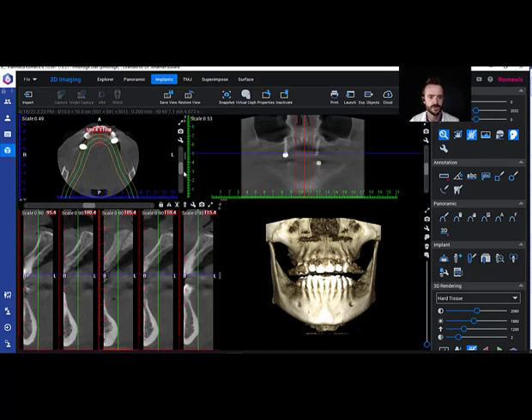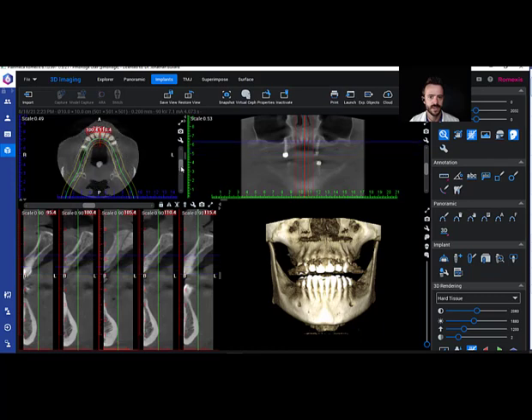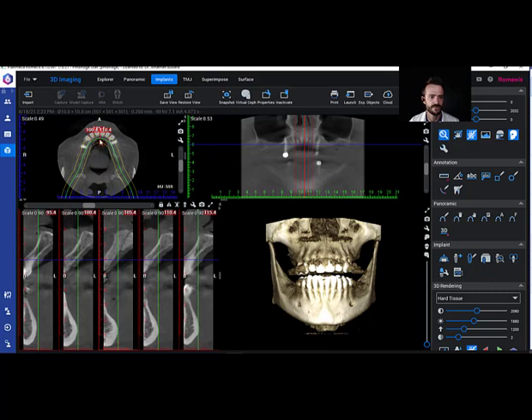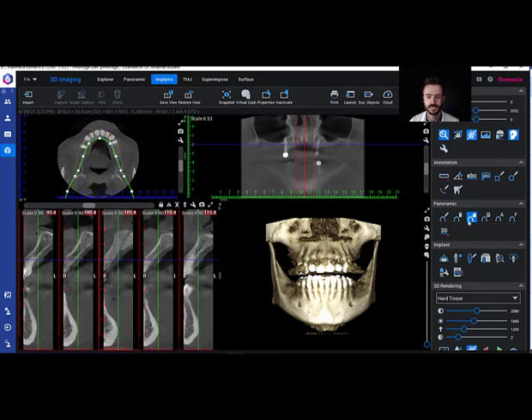What we're going to do is grab this slider bar right in the middle, slide that up to where number 5 is — running right through where we want to see. Now I'm going to look at the panoramic curve on the left, and I see it's not really lined up on the maxillary arch. So I'm going to go over to the right and go to Edit Panoramic Curve and select that.